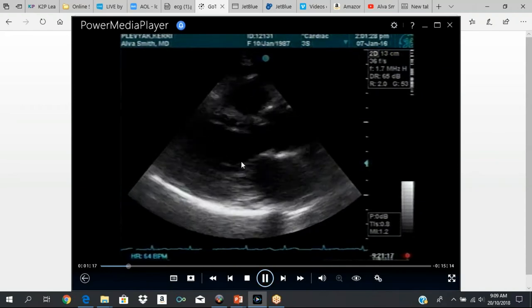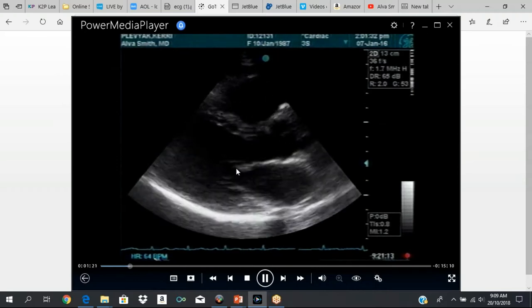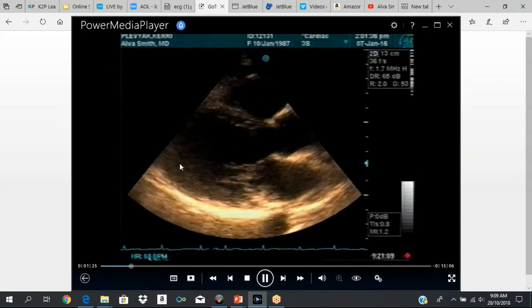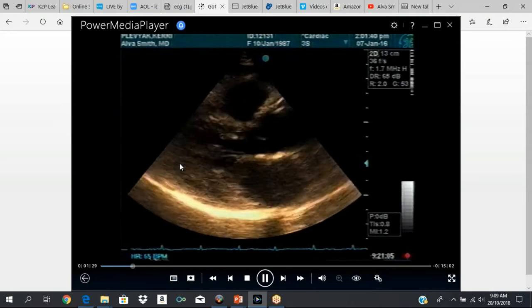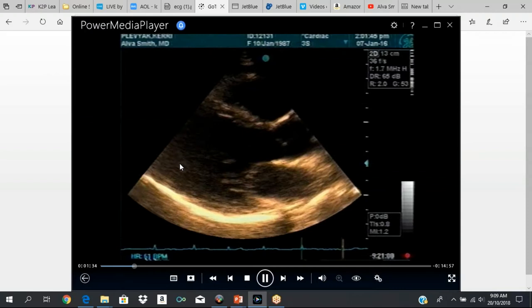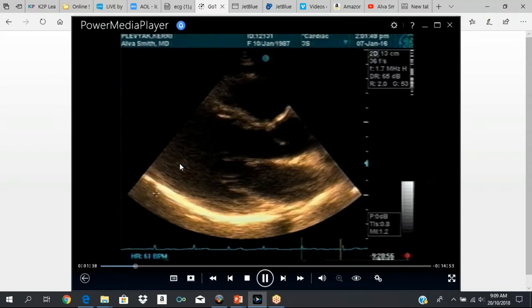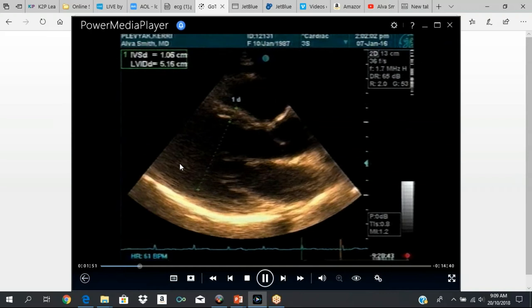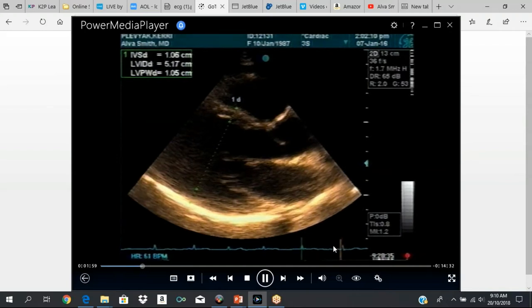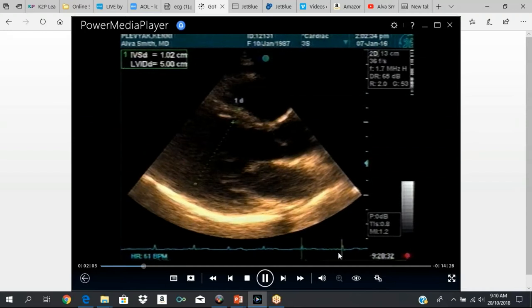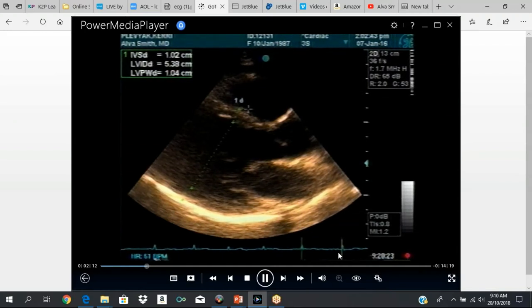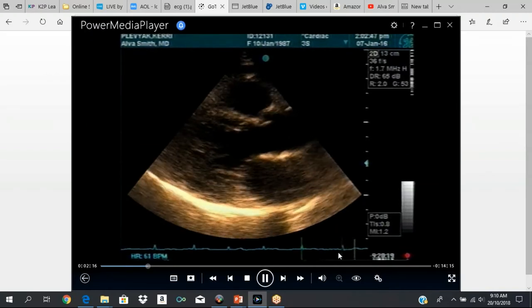You can see the anterior mitral leaflet and posterior mitral leaflet. If you look closely, you can see the chordae tendineae, which attach to the papillary muscles. In systole the heart comes in, and in diastole it goes out. The diastolic measurements include measuring your septum from one side to the other. The measurements are done at the tip of the mitral leaflet. Then you measure the LV cavity size in diastole. In diastole, the mitral valve is open and the aortic valve is closed. It corresponds to the onset of the QRS. Echo is gated — either systole or diastole — and you make your adjustments according to your ECG.